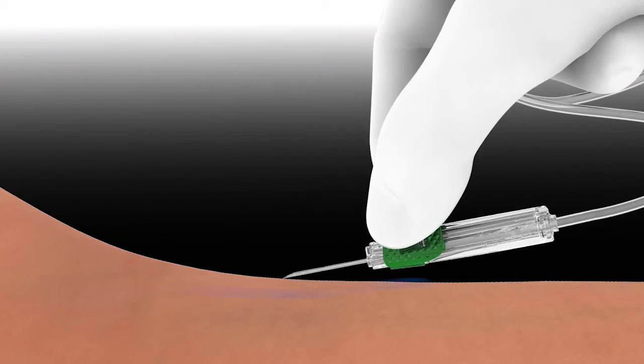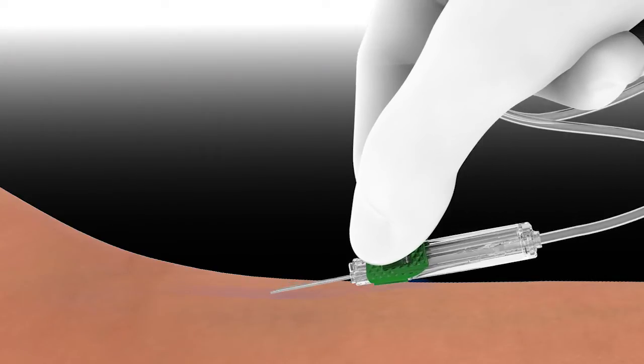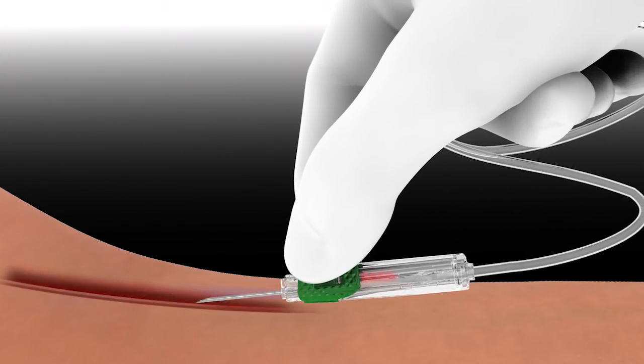Upon insertion, a flashback of blood is quickly visible through the transparent hub, confirming that the needle tip is inside the vein.